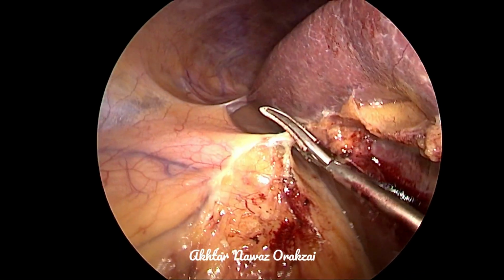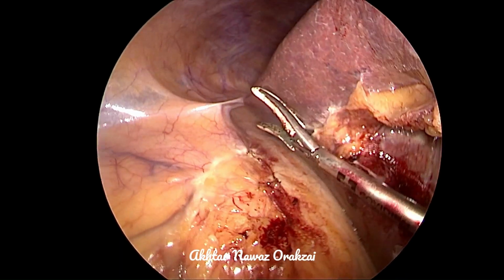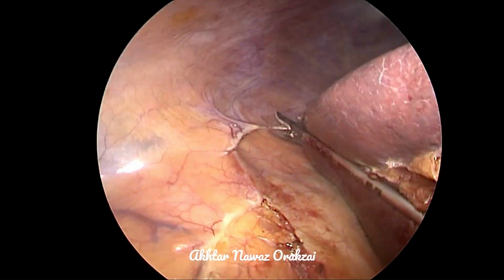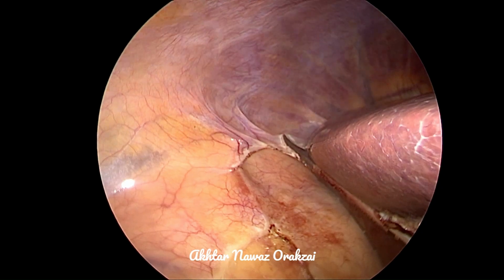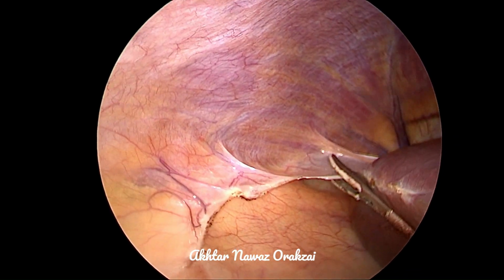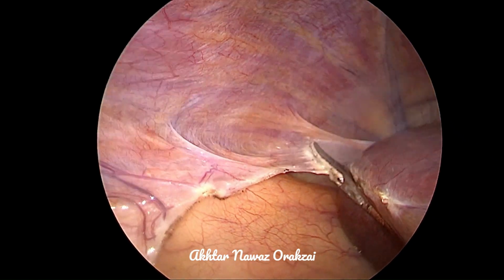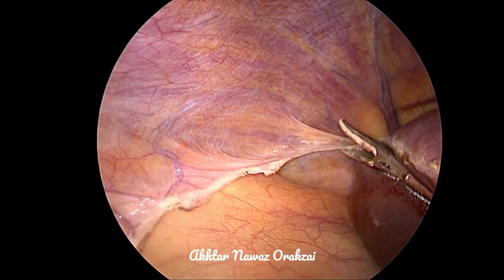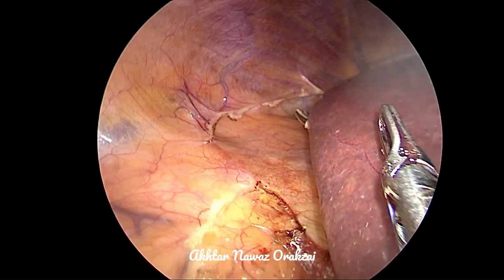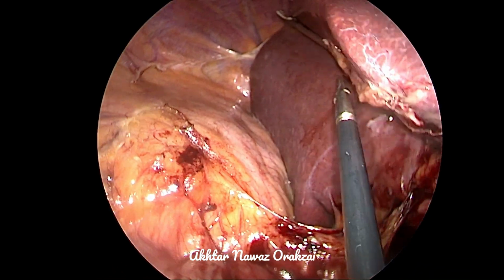However, initially, after placing the visual port, it was a surprise for us, and we had to make a plan to proceed with. So the triangular ligament is mobilized, and the mobilization of the liver is enough now.